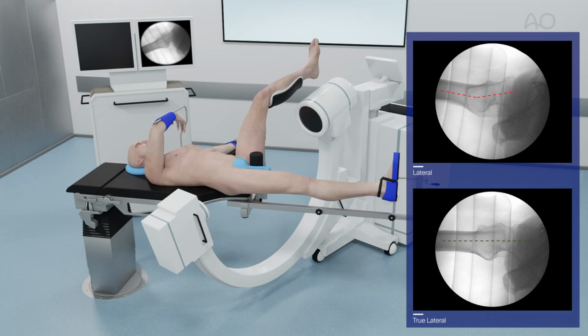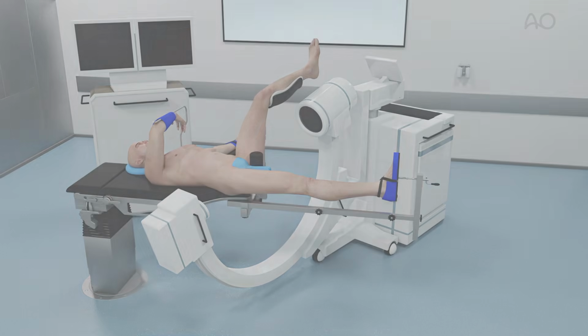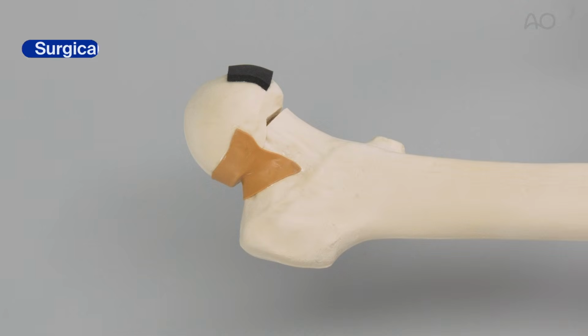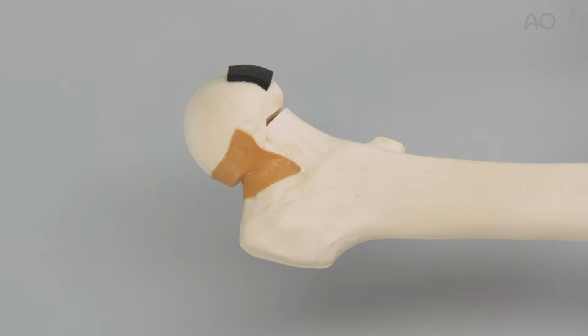Clinically, closed reduction is performed under regular image intensification in 2 planes. In a situation of suboptimal reduction, open reduction should be considered. Note that in this demonstration, the fixation of a stable valgus-impacted Garden type 1 fracture is performed in situ. However, in a case of a young patient, anatomical reduction should be considered.